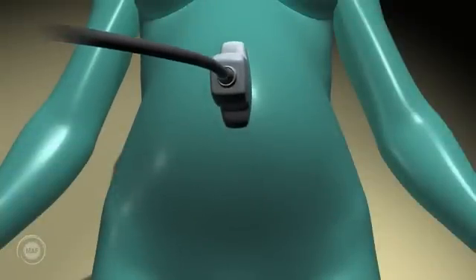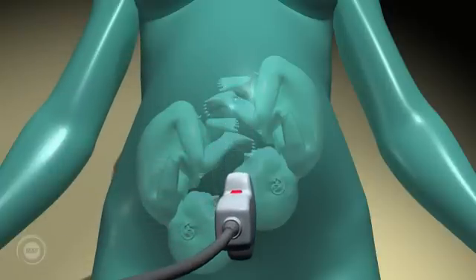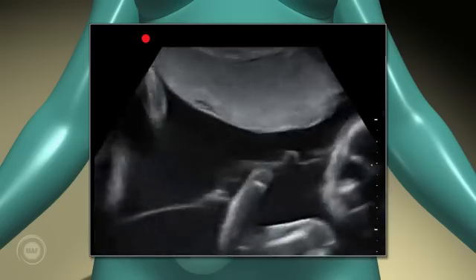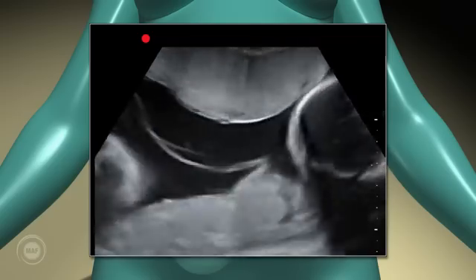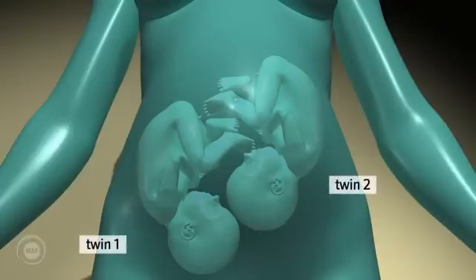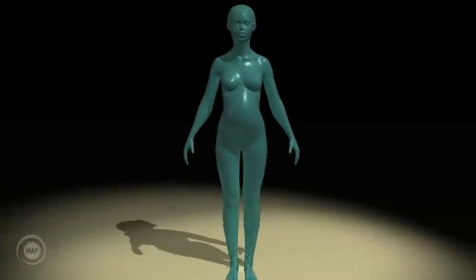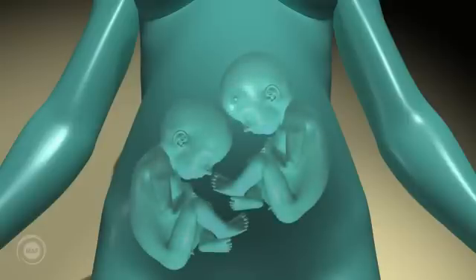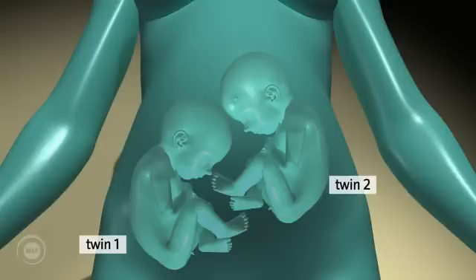Twins. During the ultrasound scan of twins, it's important to identify each twin and to describe their positioning. Twin 1 is traditionally referred to as the twin with the lowermost presenting part. In the case where both are lying longitudinally with a cephalic presentation, twin 1 will be the twin that has its head lowest in the pelvis. In the case of breech twins, the same principle applies — the twin with the lowermost breech will be described as twin 1.